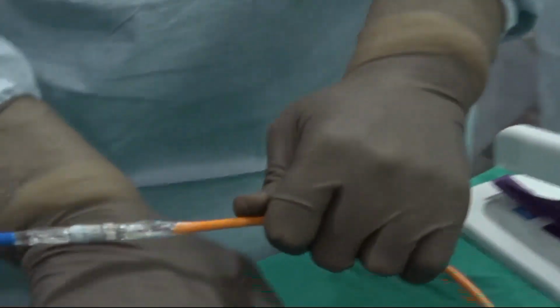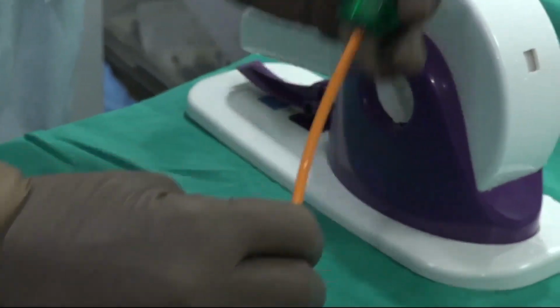That's the crimped valve. I hope you got the demonstration of the commissural alignment. Why is commissural alignment important? Because commissural alignment gives the physiological replacement of the valve, and it leads to the securement of the coronary aperture. If in future there is any coronary obstruction, we can get coronary access as with the physiological leaflet. So that is why commissural alignment is important in the tricuspid valve, and coronary alignment is important for the bicuspid valve.